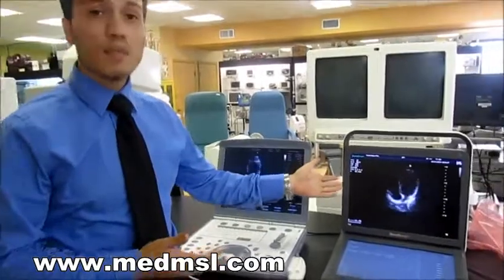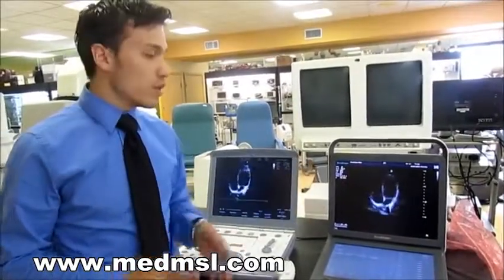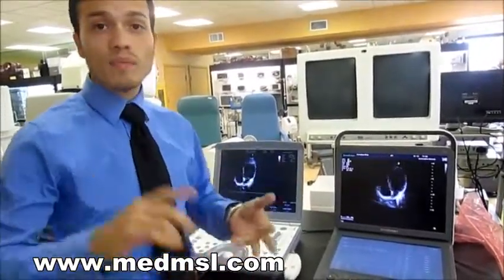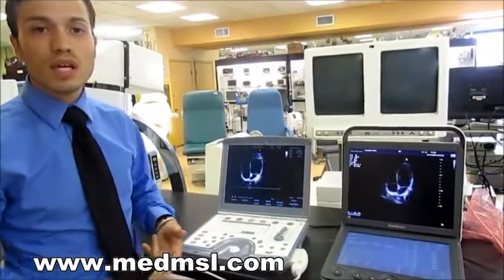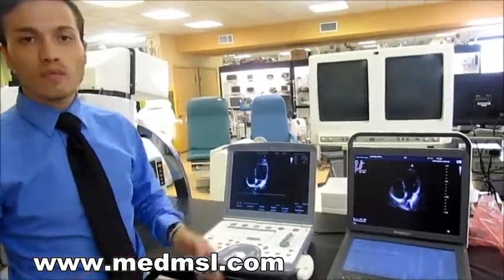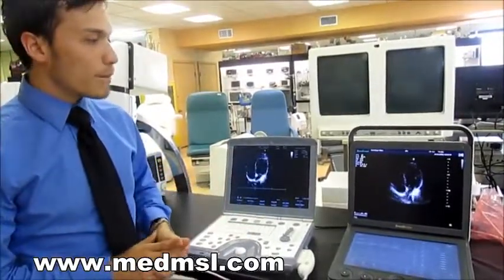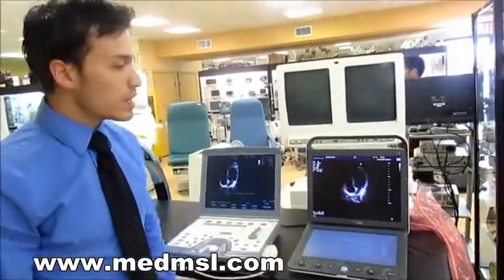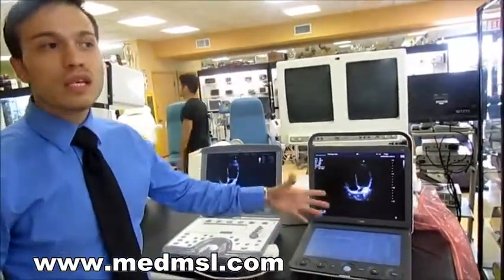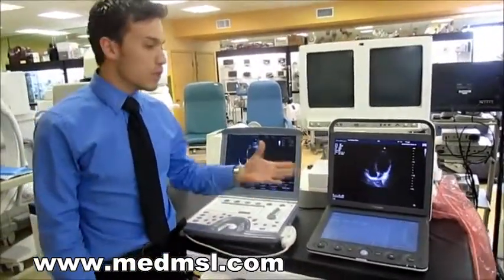A key feature of the Sonoscape S9 is that every single piece of software you need is already on this system. You already have the ECHO, regular cardiology specs, vascular studies — everything ranging from obstetrics all the way to cardiology, including 4D and 3D imaging. That's also a great selling point if you ever decide to sell the machine.